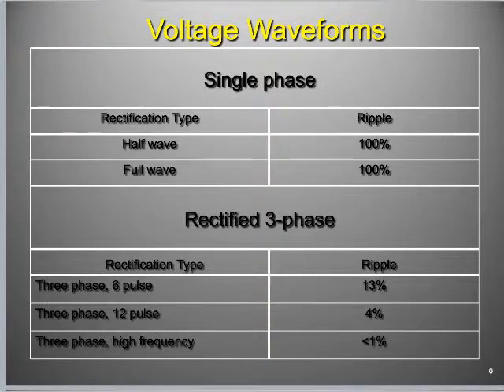But if that were the case, it would mean that every second we would get 60 pulses of power. Because we got rid of half of our pulsing, right? We've only got 60 pulses, just the power coming from Pickwick Dam, right? So that is this illustration here. That is half wave rectification. We chopped off the part of the wave that we didn't like.